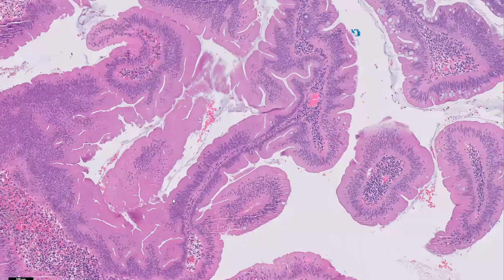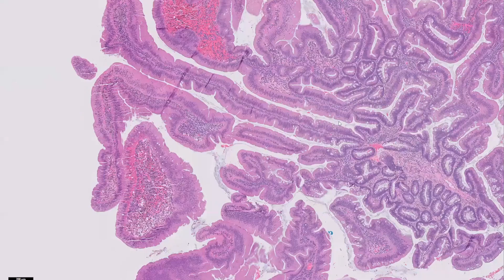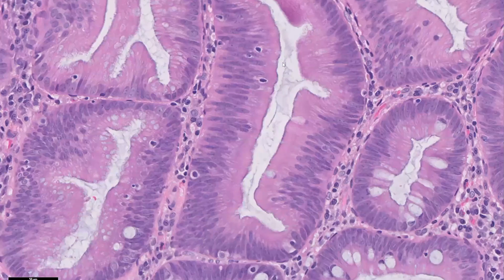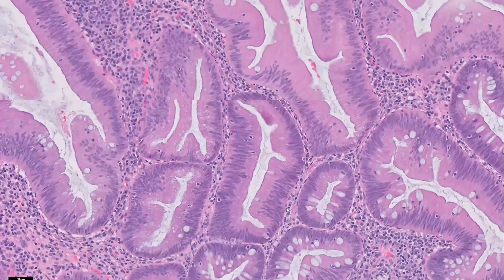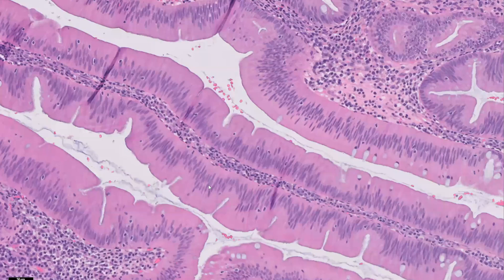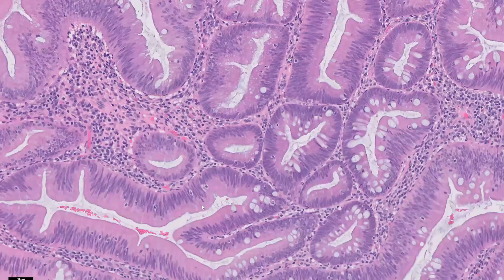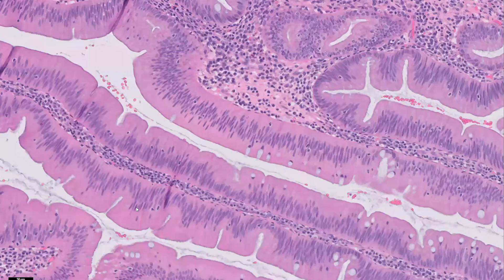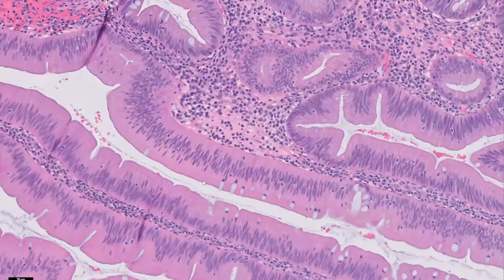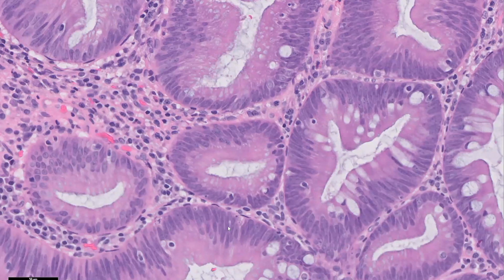The other thing you want to be able to call it serrated is that you have to see serrations — you can see serrations happening within this lesion. There are multiple nice areas of serration. The third thing needed to make this diagnosis is the actual penciled thin nuclear features of low-grade dysplasia. Compared to a traditional tubular adenoma kind of dysplasia, these dysplastic cells are very, very thin — called penciled thin — and they look very pseudostratified. Another common feature is a little uplifting from the base, whereas in more traditional adenoma, most of the nuclei hover at the basement membrane.